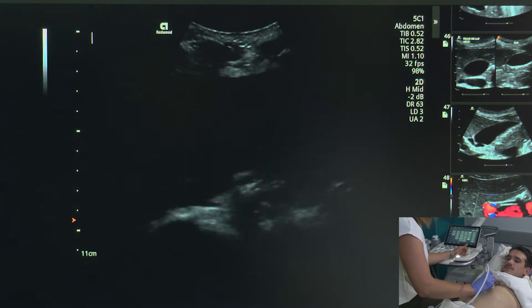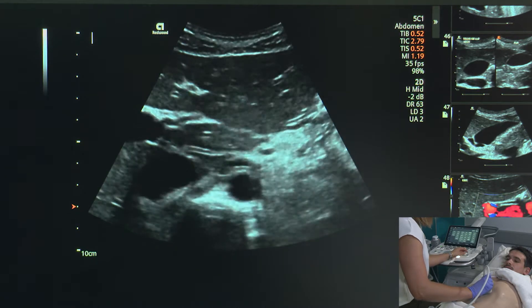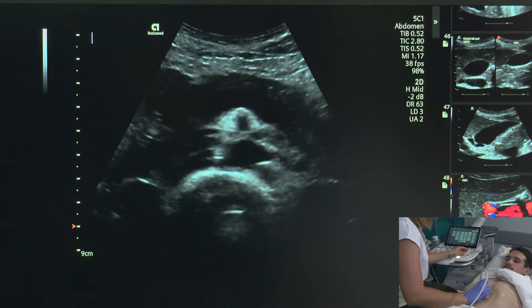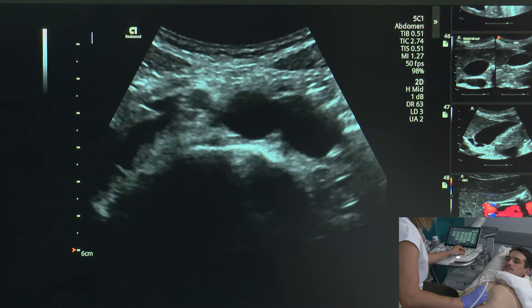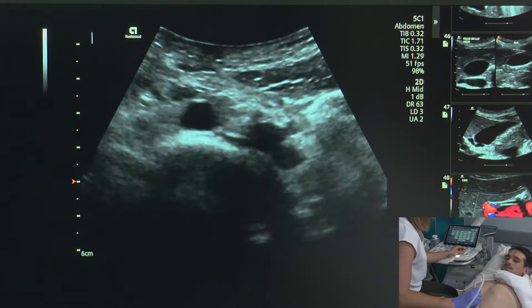Bruce, I'm going to get you to take a nice big breath in. I'm going to start sweeping, making sure that my depth and my focus stay focused on the aorta, which is right here, and we're going to go all the way down — breathe normally. I'm going to adjust my gain as we move, and unfortunately this is as much as I can change the depth, until we get to bifurcation.